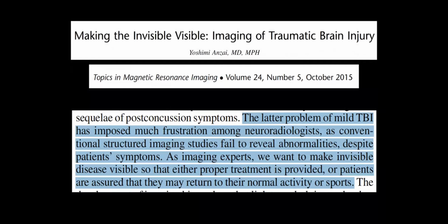And so this was a paper published 10 years ago by Dr. Yoshimi Anzai. She's actually the current president of the American Society of Neuroradiology. Even though this paper is upwards of a decade old, even back then there was this focus on making the invisible visible with imaging of traumatic brain injury. And what she writes here, and what I wanted to highlight and read to you, is that the problem of mild TBI has imposed much frustration among neuroradiologists as conventional structured imaging studies fail to reveal abnormalities despite patients' symptoms.